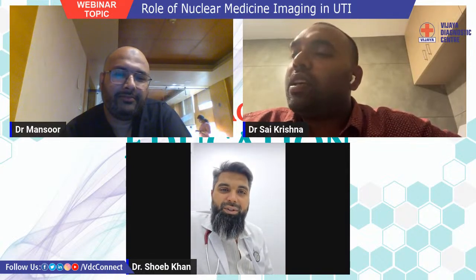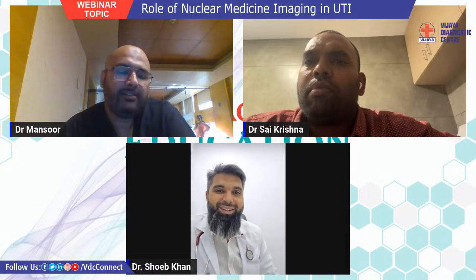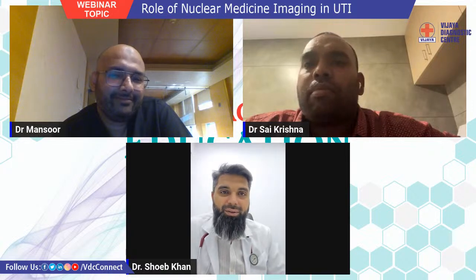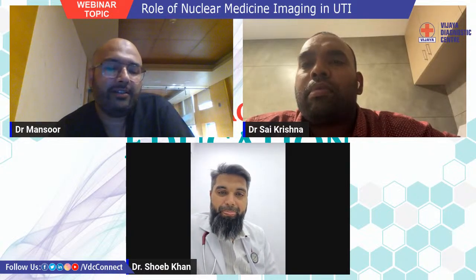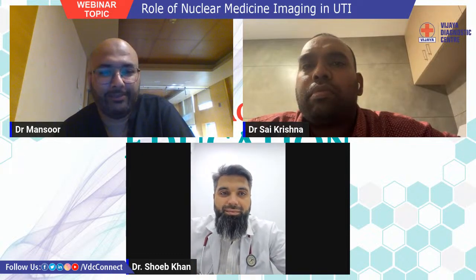One more thing, for the DMSA scan, initially it was told that we need to do it 3 months after the UTI, after the antibiotic course is over. Presently, they have brought it down to 1 month, or even during the UTI many people tell us we can go ahead and do it. Initially, during UTI there is edema, so we allowed it to subside, and that was the previous understanding. But if a requisition is asked for, we don't send the patient back saying you have not completed your 3 months.